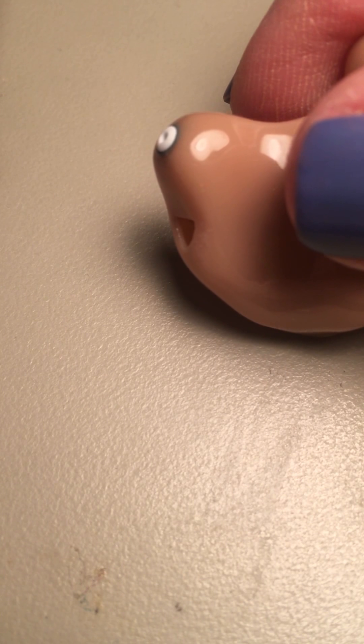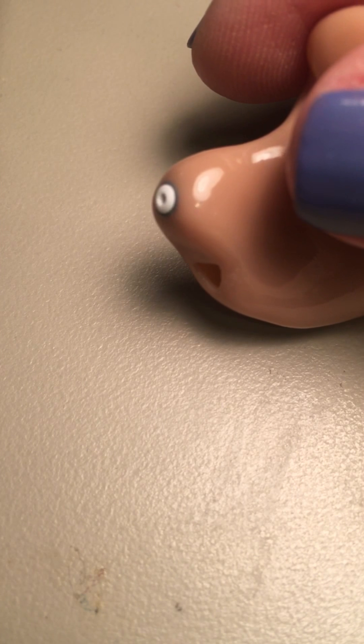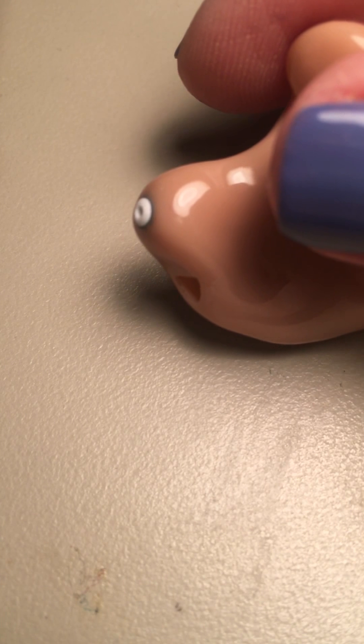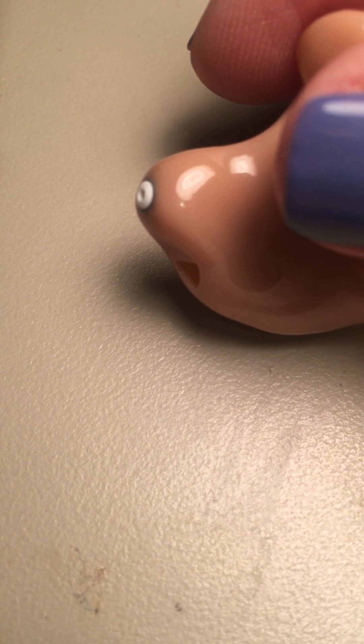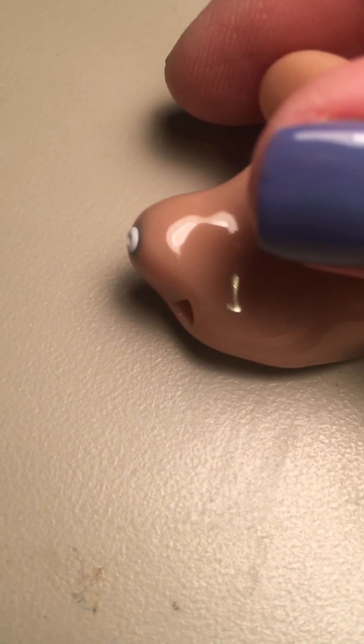Then you turn that stick around, and on the other end is already a new filter. You poke it into the hole and it should come off the stick all by itself. That's all you have to do to change that filter. Do that about once a month, or sooner if the hearing aid quits working. And that is pretty much all the maintenance you're going to have to worry about with this type of hearing aid.